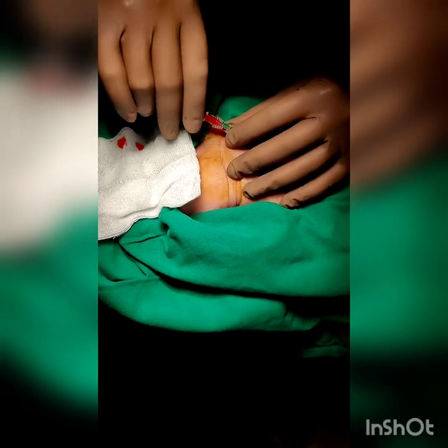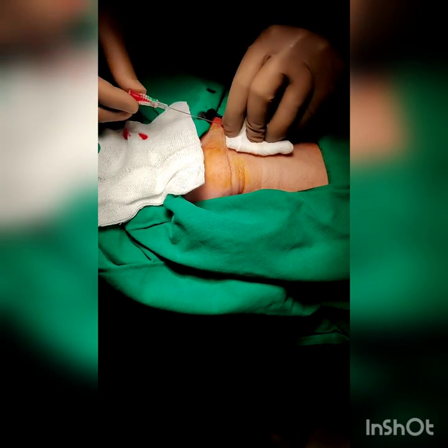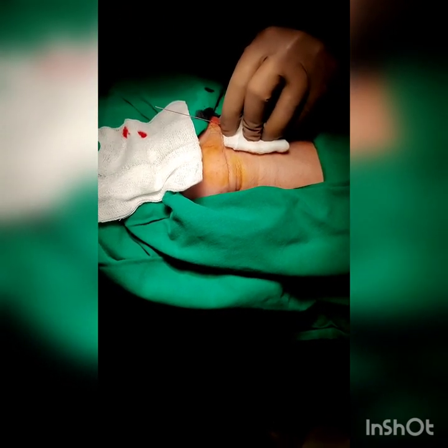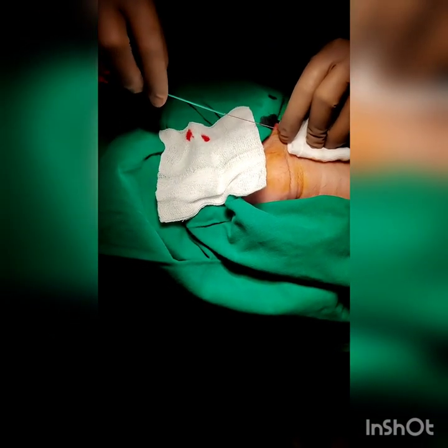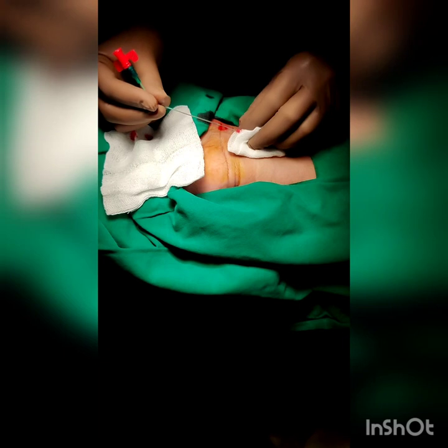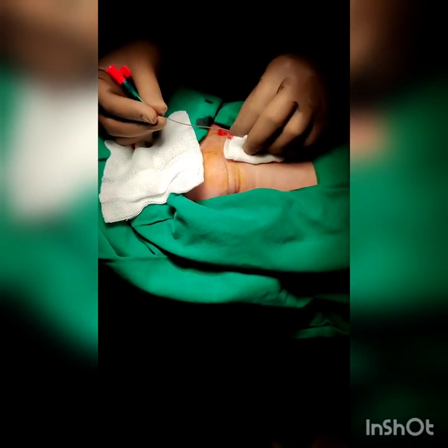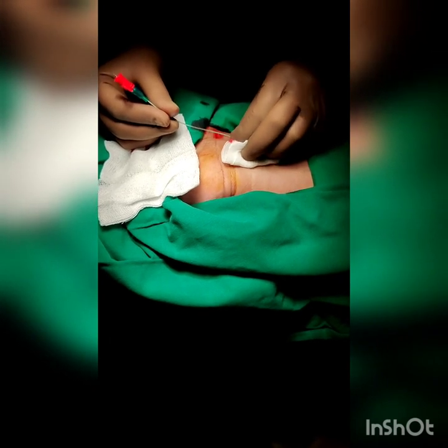The flexible straight end of the guide wire is then advanced into the artery through the introducer needle. The introducer needle is then removed over the guide wire and disposed of in a sharps container. The sterile arterial catheter is now guided over the guide wire into the artery, making sure the guide wire tip is held at all times, as you do not want to lose the wire in the arterial circulation.